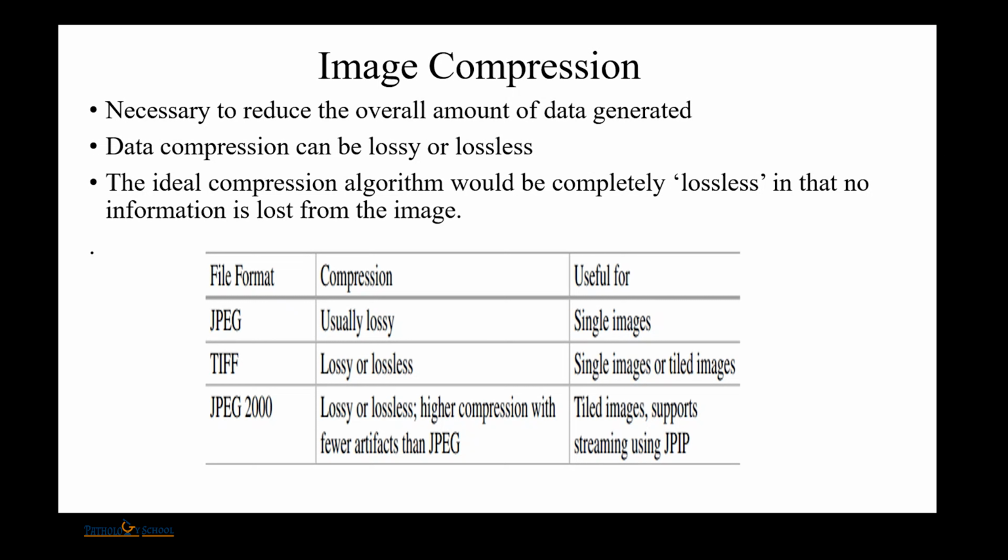Ideally, we would prefer a lossless image where the original image is not lost, and we can have the compressed image also without image loss. What we use is JPEG, TIFF and JPEG 2000, which I use. These images are stored as an image pyramid. Whenever you see these images, they have a low scan, then 20x, and then 40x. They are stored as image tiles.